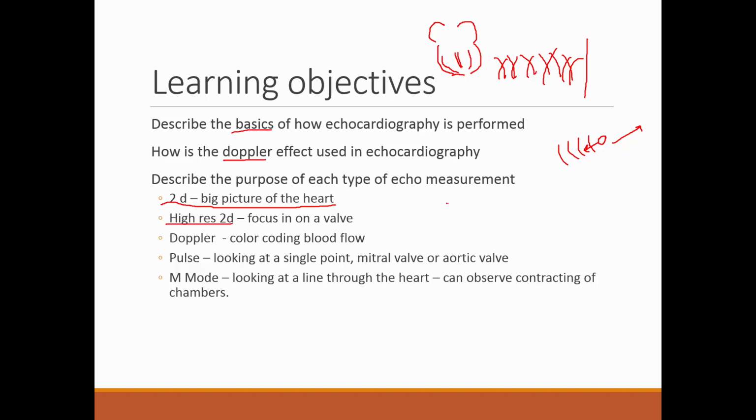So you had the parasternal axis, and then you saw the mitral valve. It's open, and then it was closed. And you could see this thing kind of flapping back and forth. So you could actually observe the valve open and close.